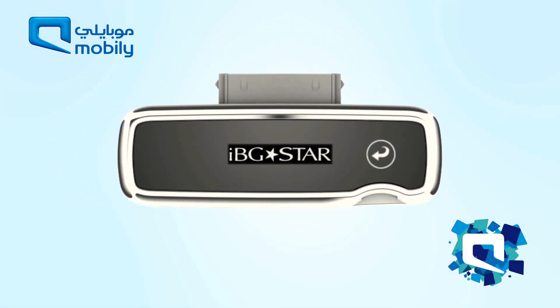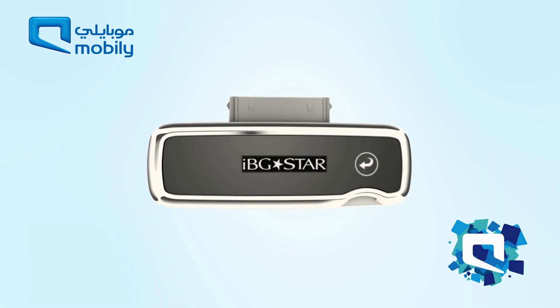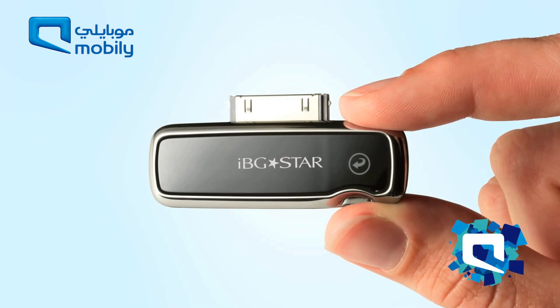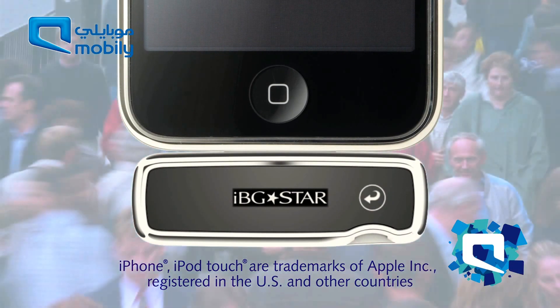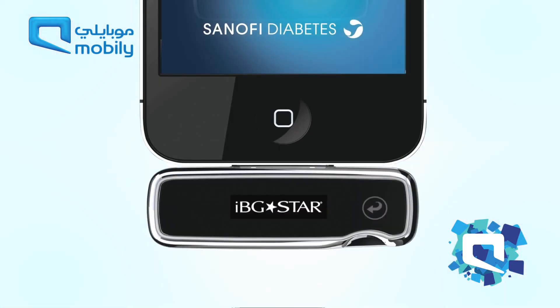IBGSTAR has been designed from listening to the needs and desires of people with diabetes, to deliver 21st century technology in a modern device for the way we live today. This stylish and discreet blood glucose meter is the first that can be connected to an iPhone or iPod Touch, so that people with diabetes can feel confident to make diabetes-related decisions even when on the go.